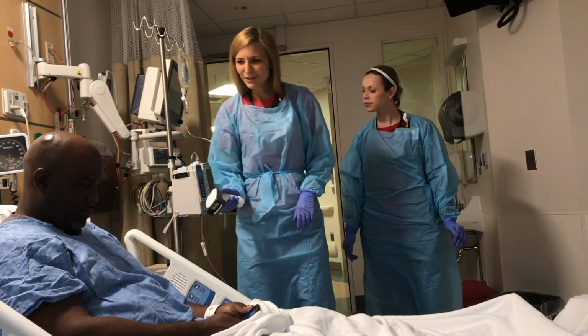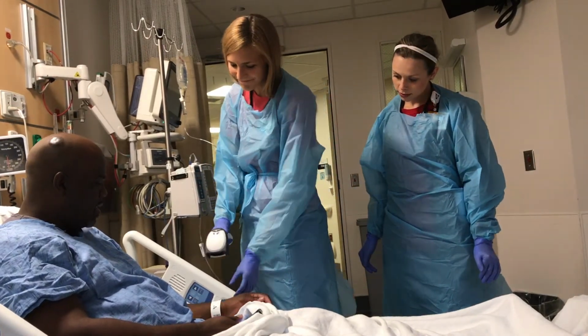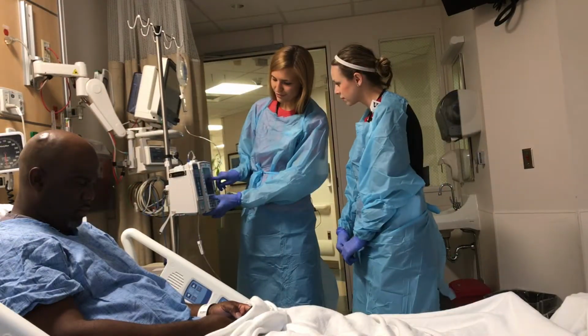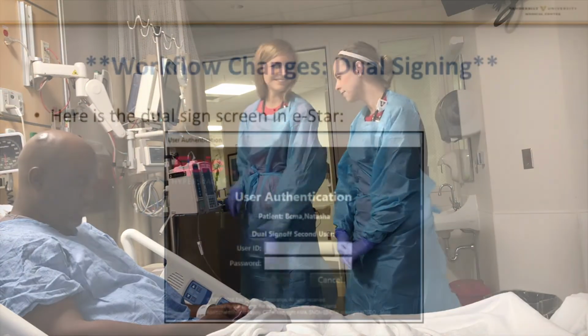Hey, what's your name and birthday? It's Mr. Holiday. It's 22276. Okay. 2,000 units an hour.